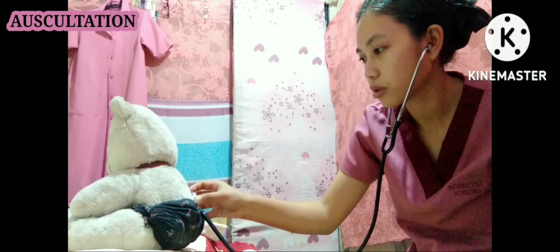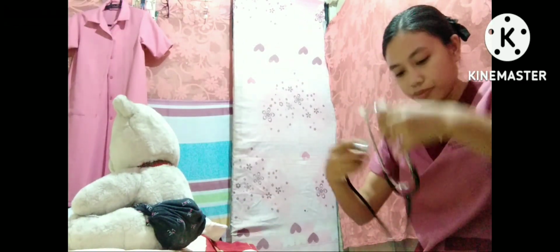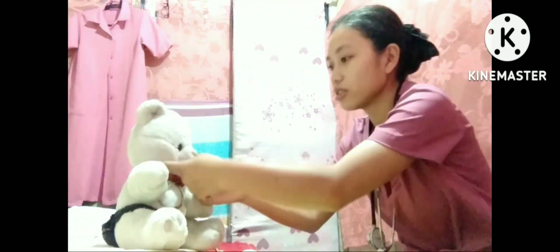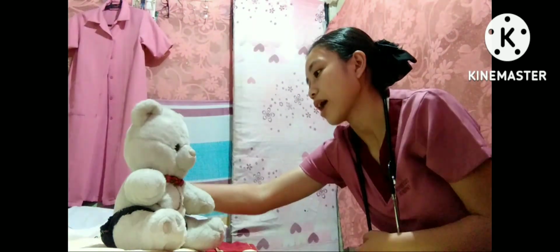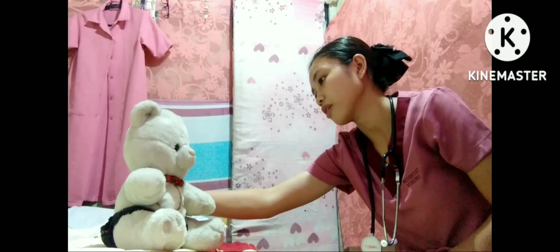Okay, one more. Okay. So you can turn. So over the trachea, I hear bronchial breath sounds over this area. So the center near the sternum, and also at the back at the upper area, I hear bronchovesicular breath sounds, and all of the periphery out here, and posterior and all the periphery out here, I heard vesicular breath sounds. Okay, so that concludes the assessment of thorax and lungs.